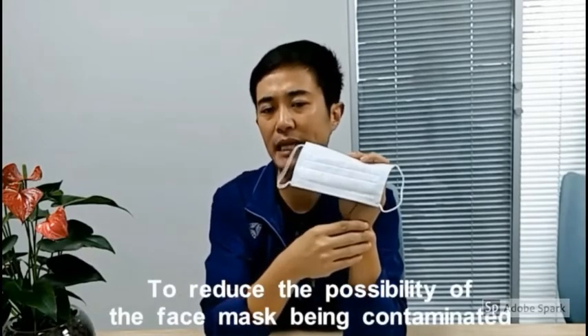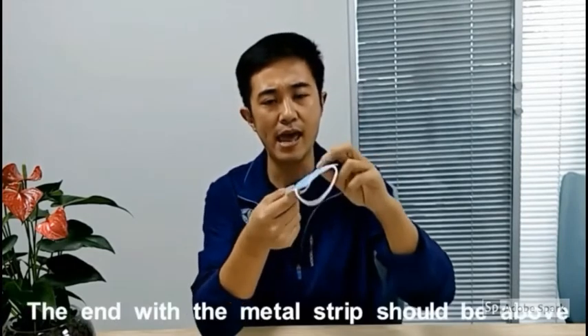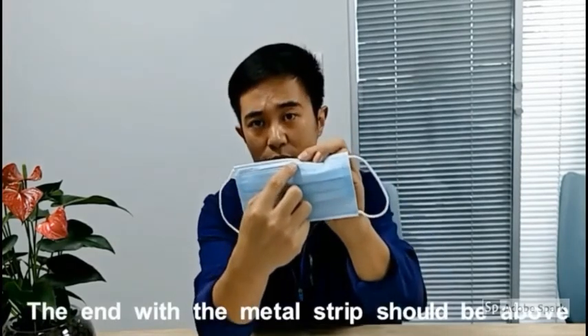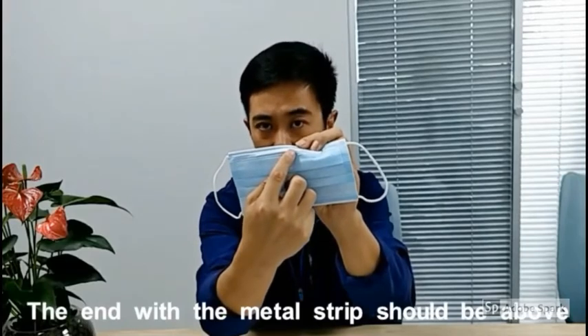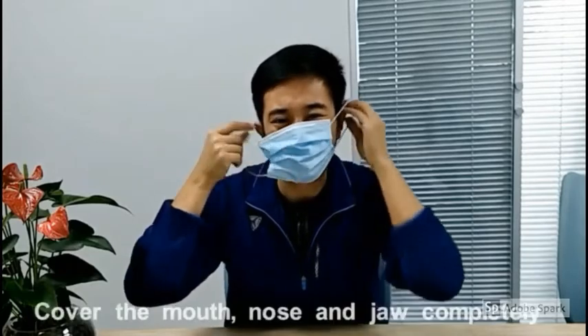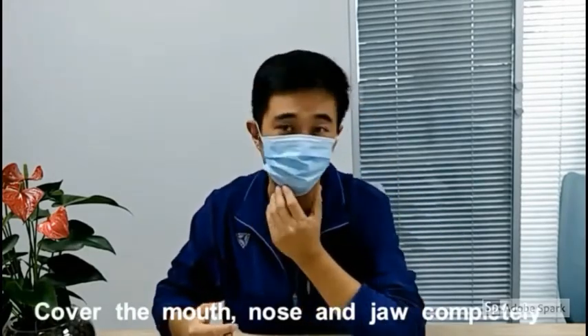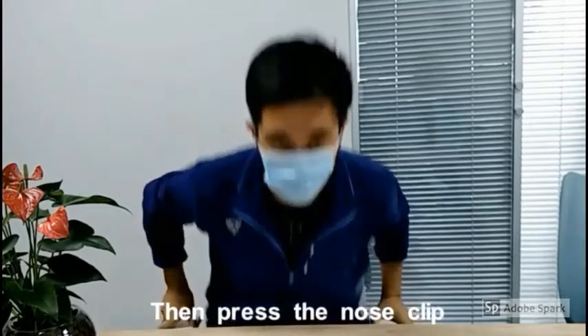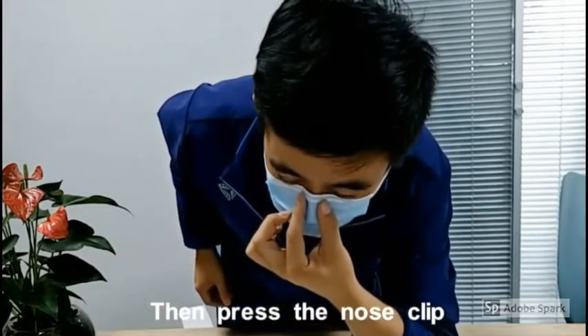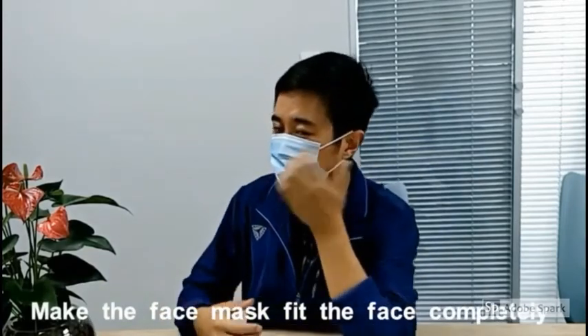To reduce the possibility of the face mask being contaminated, the end with the metal strip should be above. Firstly, fully unfold the folded mask. Cover the mouth, nose, and jaw completely. And then, press the nose clip to make the face mask fit the face completely.